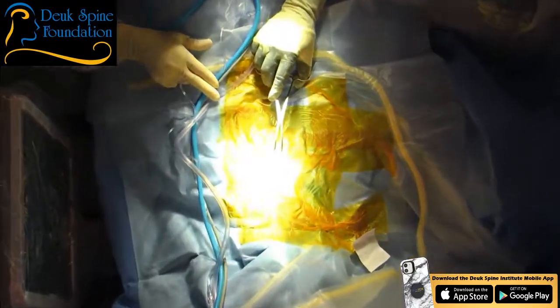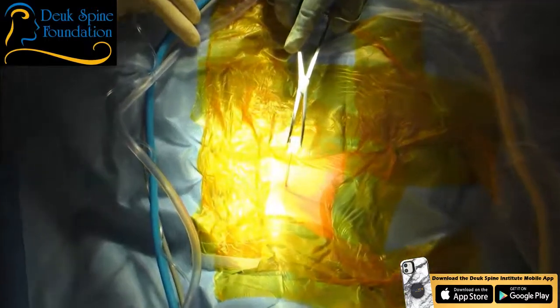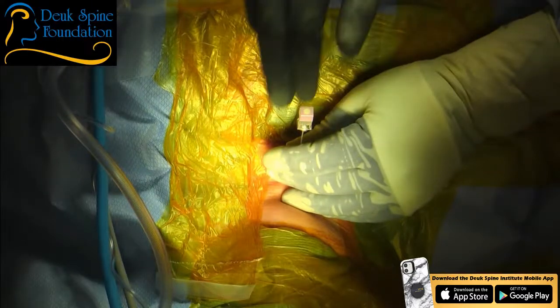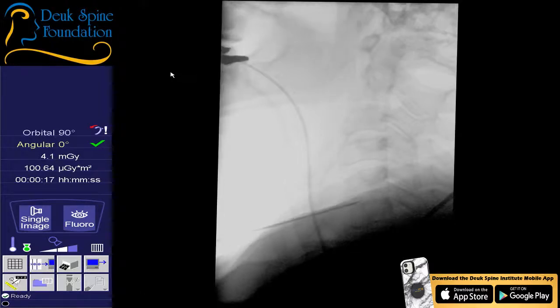We're just gonna go back to a lateral view. So we're starting at C5-6, 2-3-4-5-6. Everybody in agreement? We're at C5-6. Our patient has a thick neck, but we're fortunate enough and stay there. Jordan's done a phenomenal job. Shot. Yep, stay there. Okay, we're gonna do our discogram. So you're doing great, Jordan.